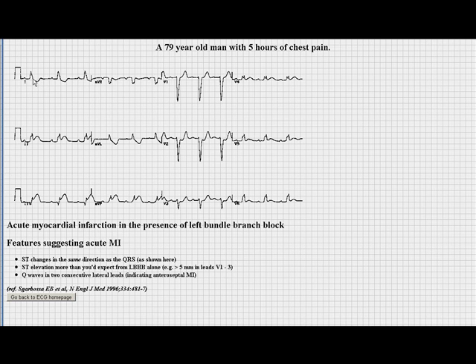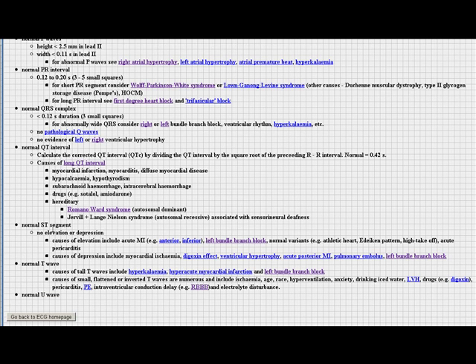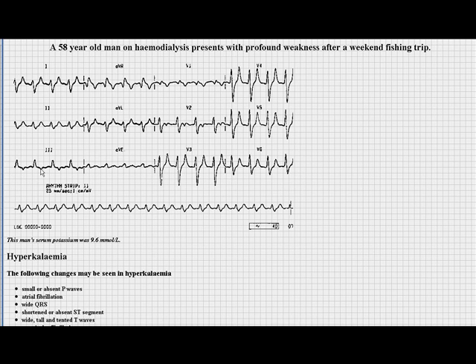The reason you wouldn't be able to flush out potassium and you change this whole repolarization is because there's not enough blood flow. So generally any kind of change in the ST segment or the T wave upon exertion would indicate difficulty repolarizing, an abnormal repolarization path that's probably tied to the decrease in blood flow, making it hard to wash out potassium. And you can also see it just generally with hyperkalemia. Hyperkalemia again is going to reproduce the conditions of not being able to flush out potassium. There's too much potassium. It makes it hard for the cell to repolarize, and that changes the repolarization pathway.